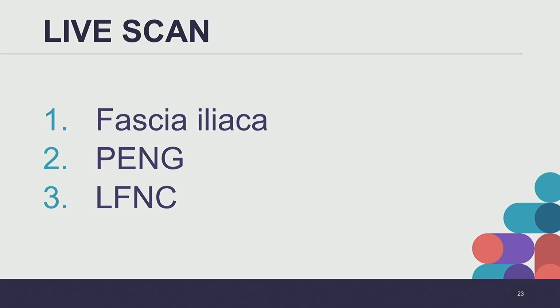Right about this level, you're going to see this really fat iliopsoas muscle. And then remember, the dress to impress block, right? So this is the bow tie. Here is the pinch, the neck of the bow tie. Here is one leaf of the bow tie, and then the other leaf of the bow tie. Right is sartorius, and this is your internal oblique, and we see the circumflex artery.